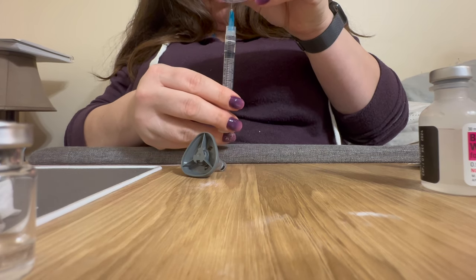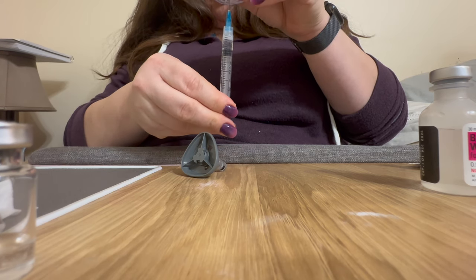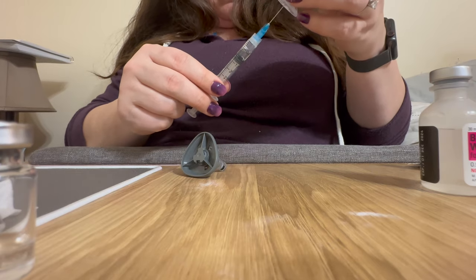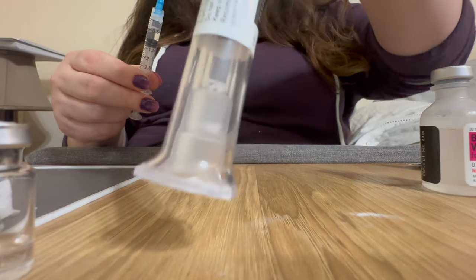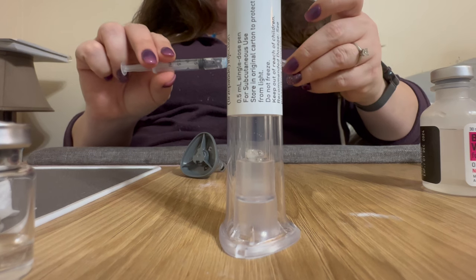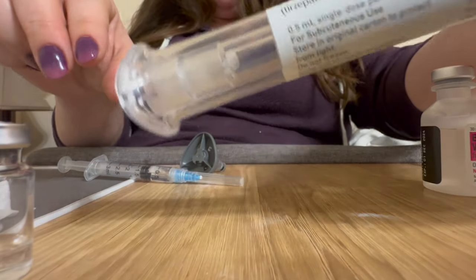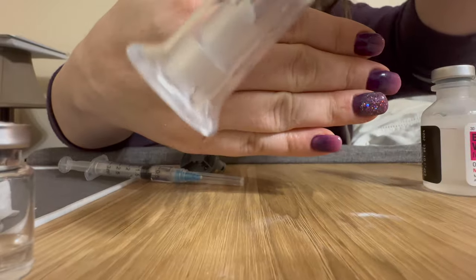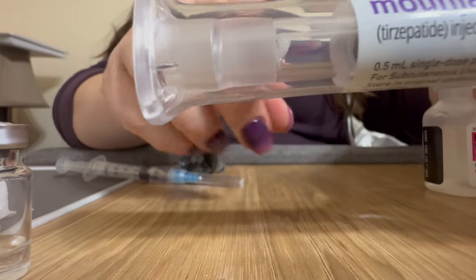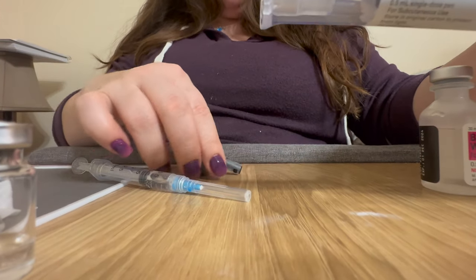The whole thing comes right out into the other syringe. You can see inside there — I'm going to cap this just so I can show you. You can see there's no more medication in the pen. Usually you would see a bubble going back and forth in the Mounjaro, and that is gone because all the medication is in this syringe.